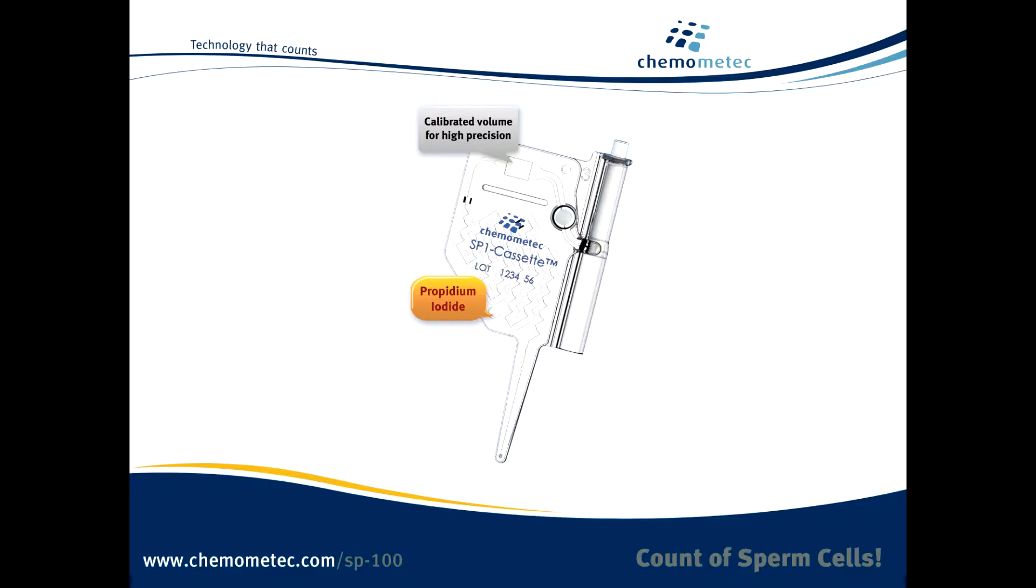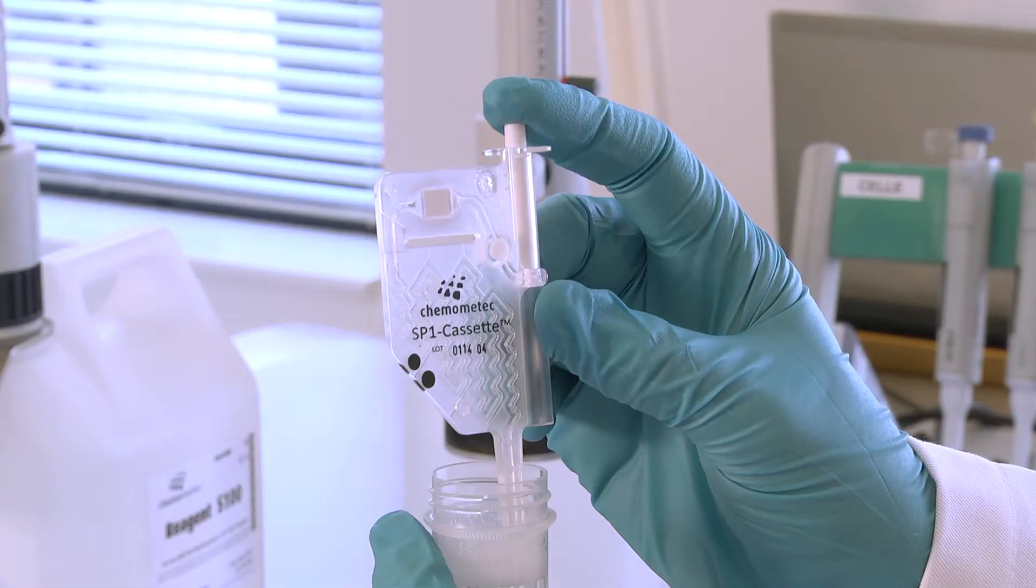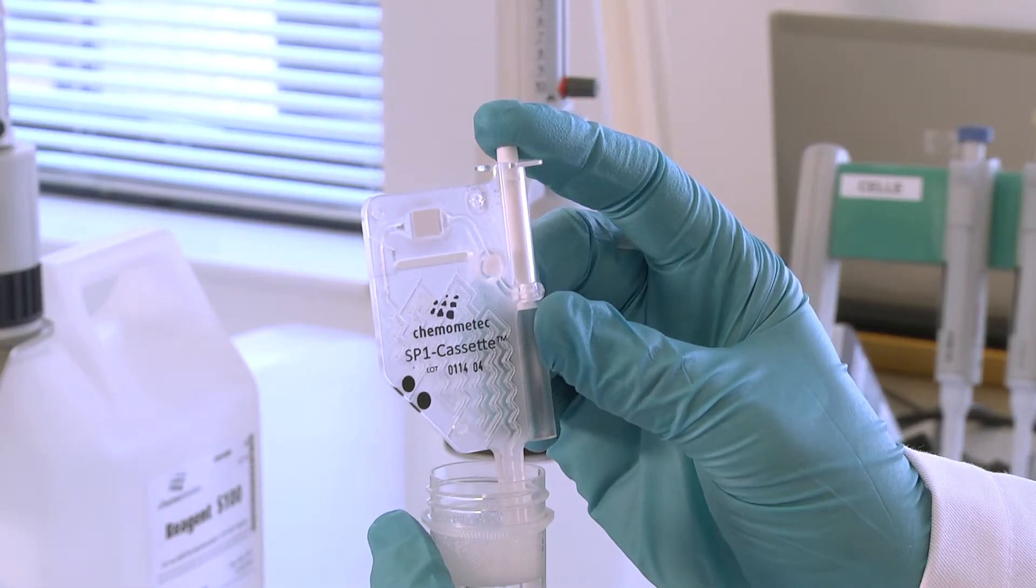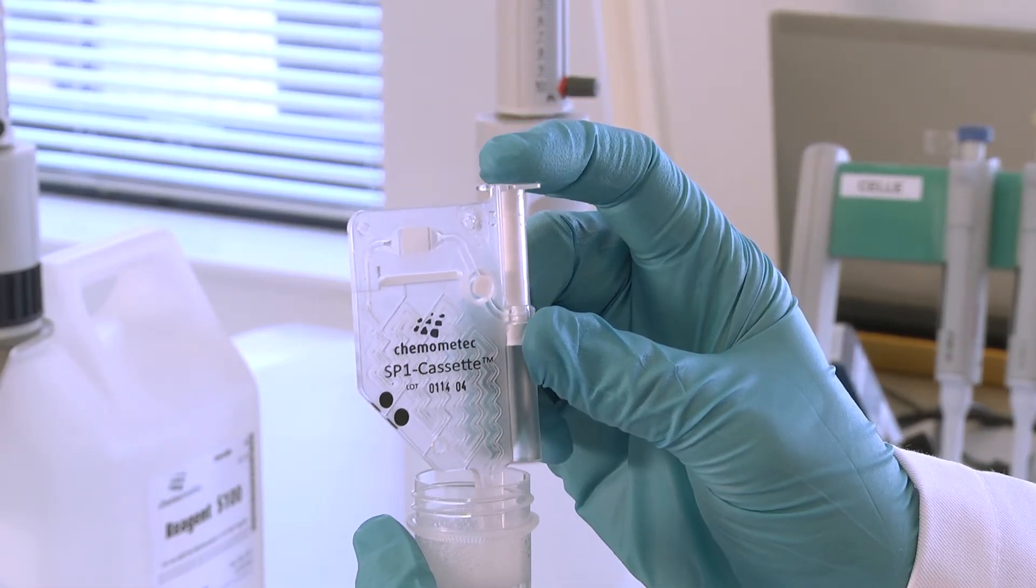The secret is the SP cassette. It contains the dye that stains the DNA of the sperm cells. The volume is pre-calibrated, eliminating human subjectivity and everything is self-contained so there's no exposure to hazardous materials.